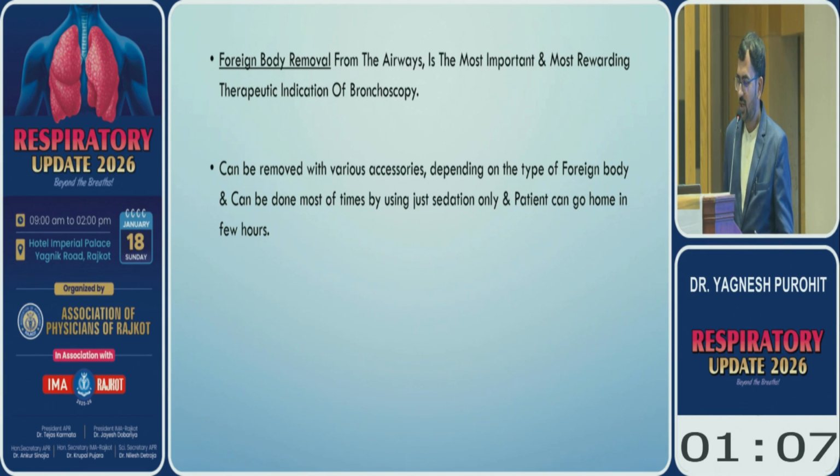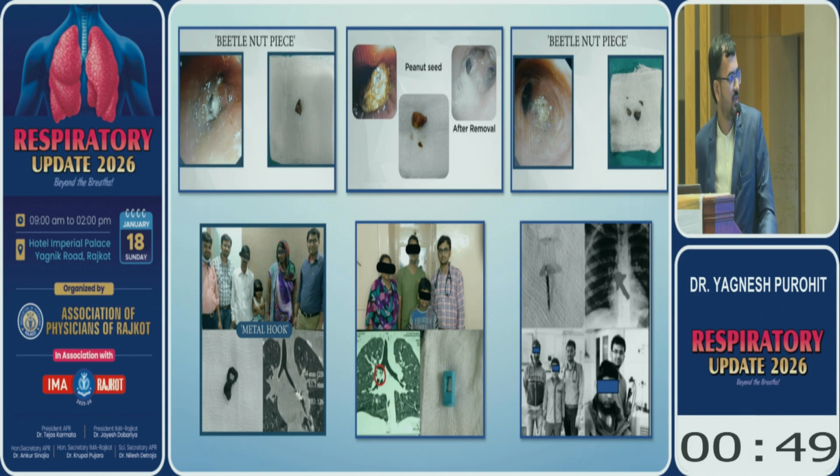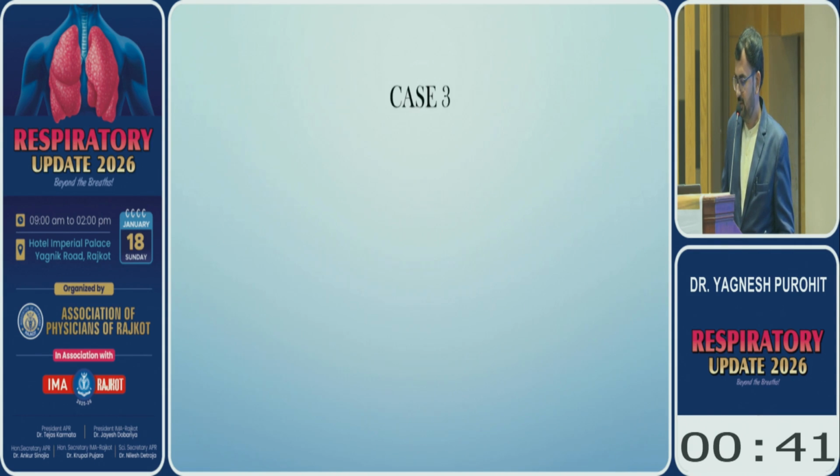So foreign body removal from the airways is one of the most important and most rewarding therapeutic indications. We have removed many foreign bodies, and in almost half of the cases it was the betel nut. So thanks to the unconditional love towards mawa chewing in our society, we have removed a metal hook, plastic pin, notice board pin, and many things. So it is a most rewarding thing.